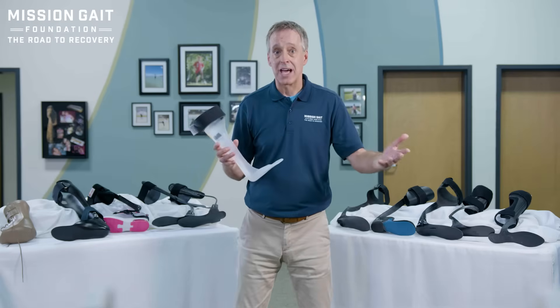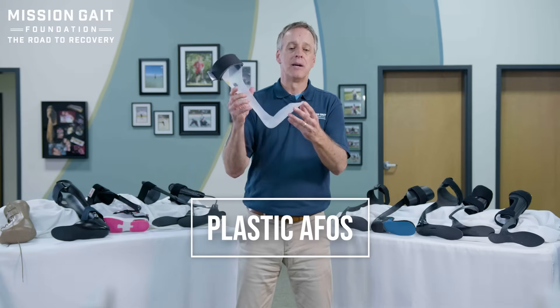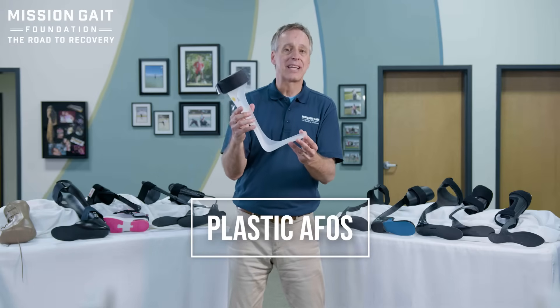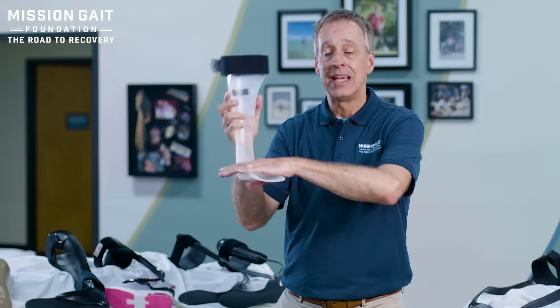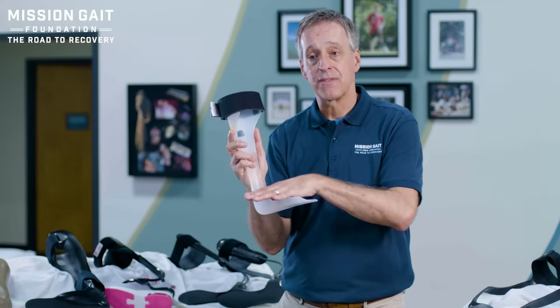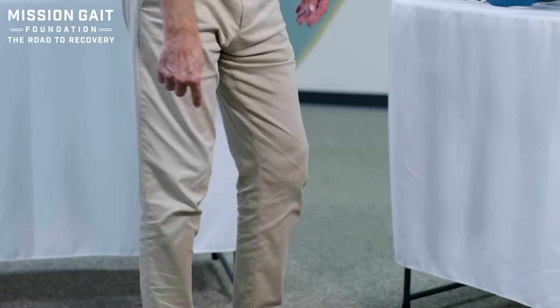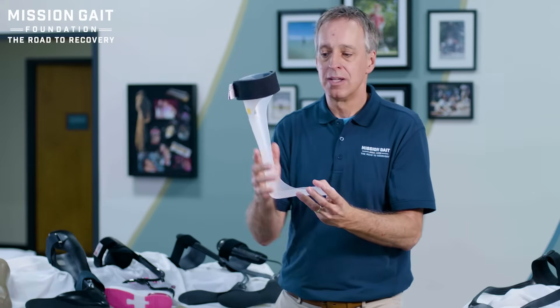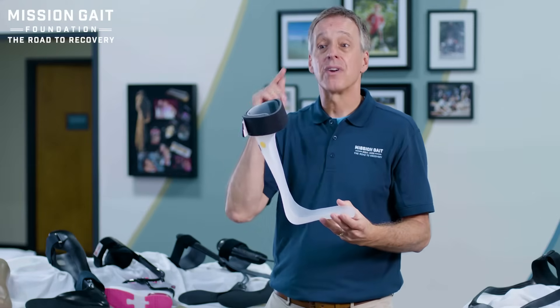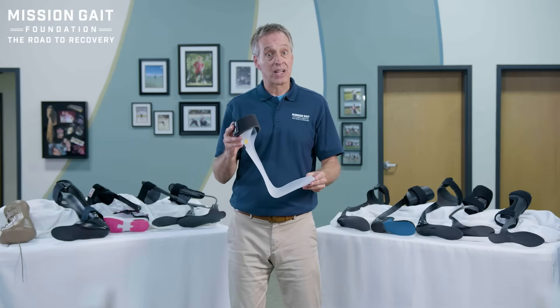Let's start with true drop foot and plastic AFOs. This is your most basic PLS — posterior leaf spring — plastic AFO. It will hold your foot up if it's dropping, but it's not going to give you much stabilization. It's certainly not going to help with tone issues, because tone creates an extension moment at the knee where the knee is going to pop backwards. As you come over the top, this brace will push that knee back into hyperextension, so it doesn't actually help that issue. It can be a good brace for a very limited scope, but it is very lightweight.